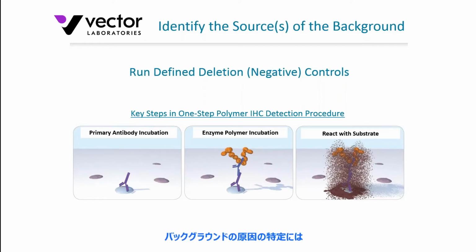So if you are encountering background, as we mentioned earlier, identify the source of the background. And the idea would be to run your defined deletion controls. What I've got here is a schematic of a one-step polymer immunohistochemistry detection procedure. The cartoon shows primary antibody, followed by your enzyme polymer, and then reacted with the enzyme substrate. So what this assumes is you've already done the tissue prep, antigen retrieval, you're quenching, you're blocking, and then you put on these given detection reagents.